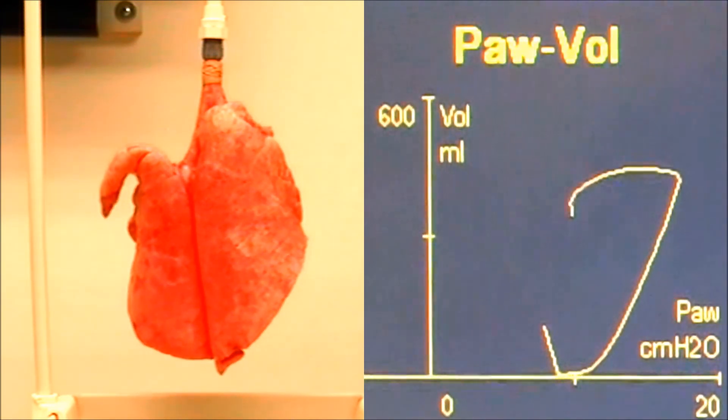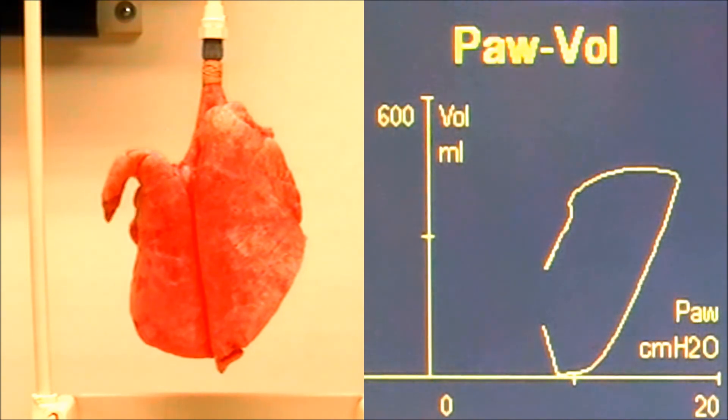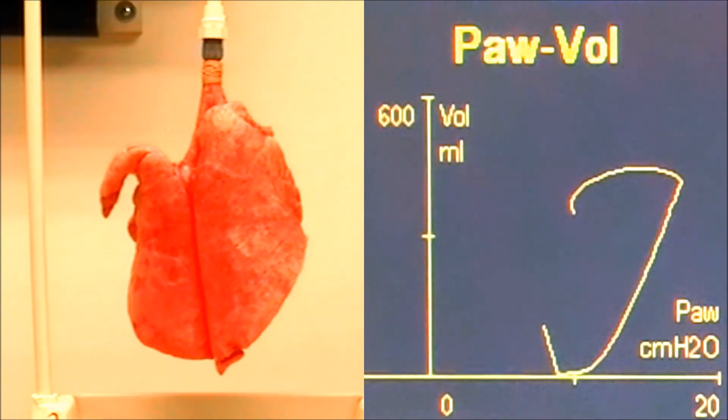If you look, I went to APL, but after the recruitment breath, my lungs look a lot better. I may even need more PEEP to keep my lungs fully recruited.